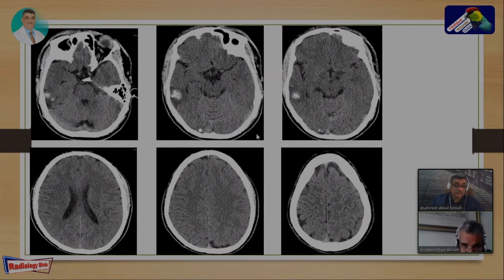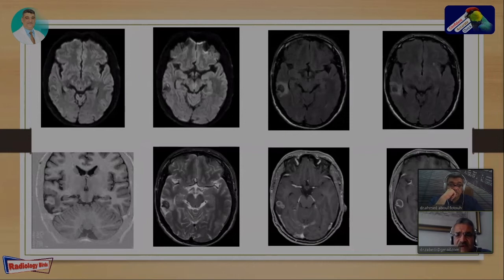And they didn't phone me at the same time. They wrote that as intracerebral bleeding. Of course, I know that there are a lot of patients who have intracerebral bleeding, even bigger than this, who will not go to such a severe or deteriorated situation as this young patient, because there is no compression of the ventricles and there is no rupture to the ventricular system. I mean, it is a small bleeding, if it is bleeding. Anyway, it's still hyperdense. It was suspected to be bleeding.